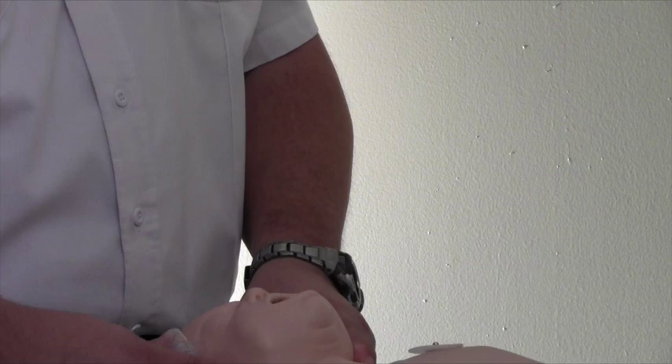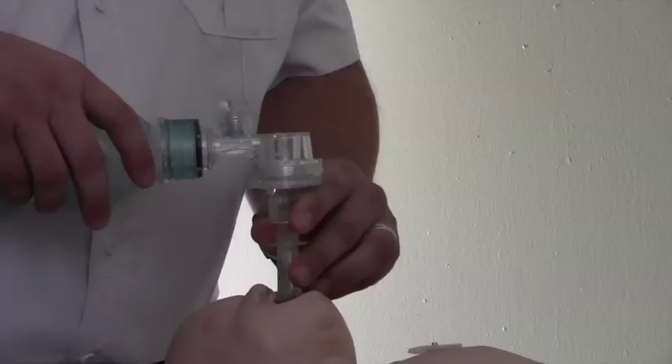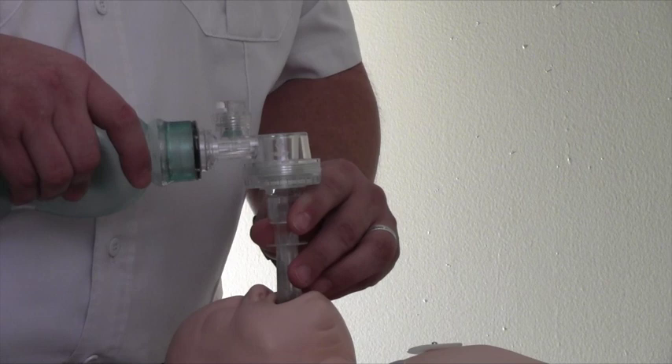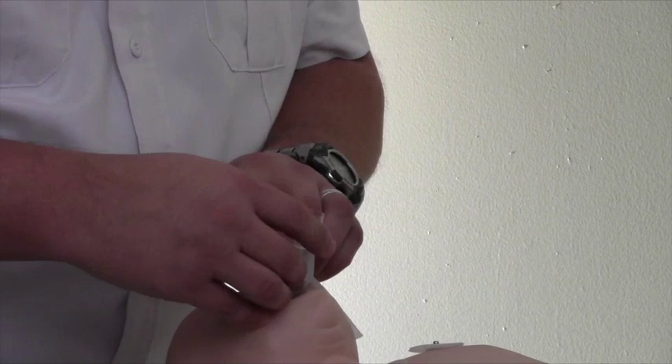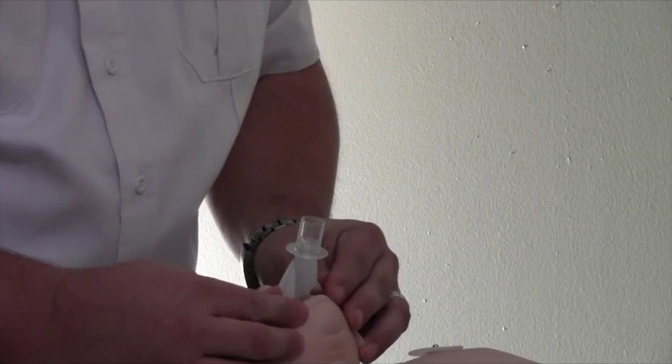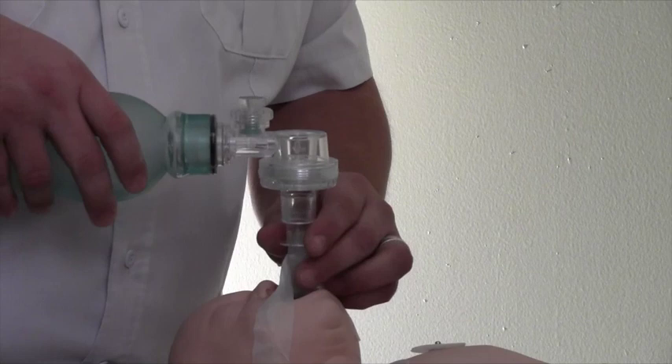IGEL placement in an infant. As with the adult and child, the airway is inserted in the same fashion. The infant sized IGEL does not come with the securing strap, nor does it have the supplemental oxygen port. Tape must also be used to secure the tube. Also note that there is not an NG port for the infant sized IGEL. The elbow connector also fits on the infant sized IGEL.